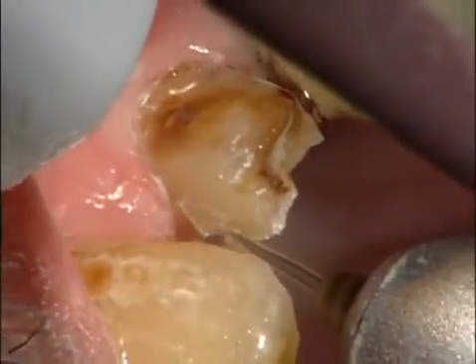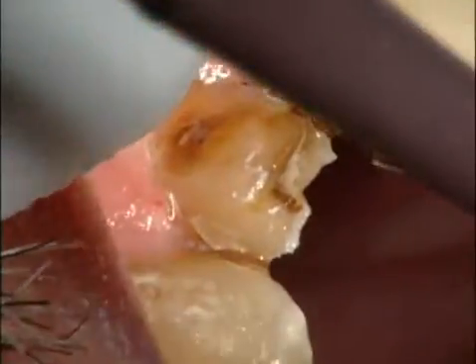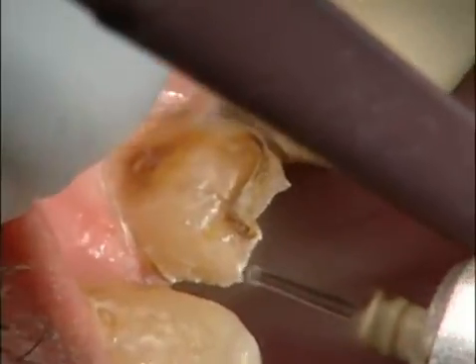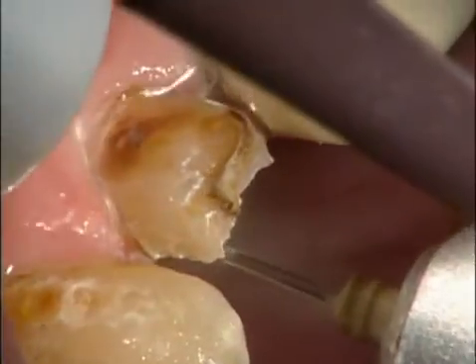Well, it's an almost predictable situation. When you've done this much laser work, we know that lasers desensitize teeth. So the more I work on a crown prep, the less sensitive the tooth will be when I'm all through.